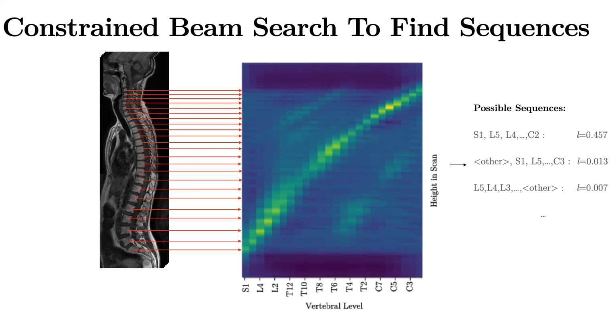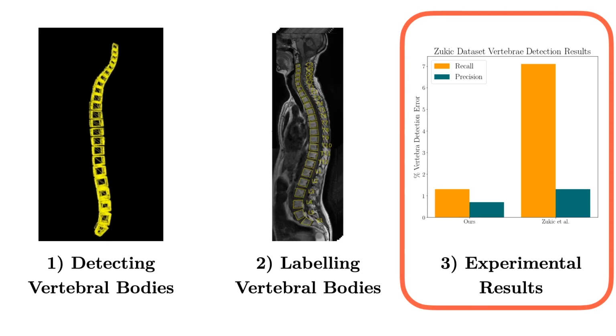Here we take inspiration from language modelling and use a beam search. As well as generating several possible candidates for labelling a sequence, this also allows us to build in constraints. The exact details of the beam search we use are in the paper.